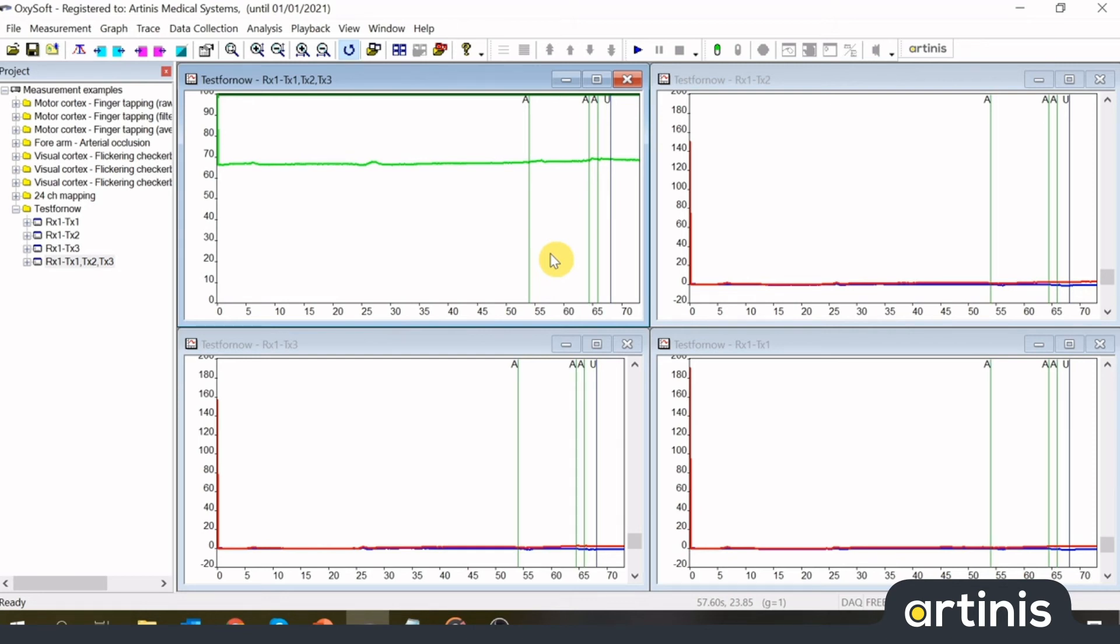Whenever you relocate files, it is important that you move both the raw data files as well as the oxy project if you want to maintain the events that are added later. You can also incorporate them in your measurement by exporting the file as an oxy-4 file.